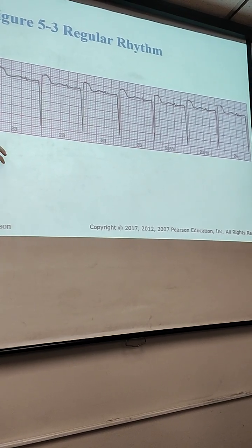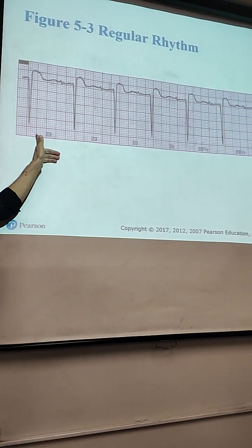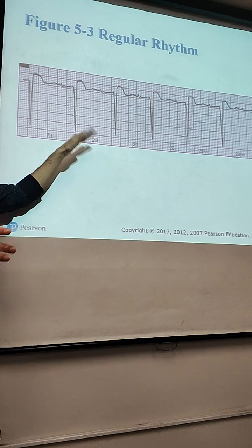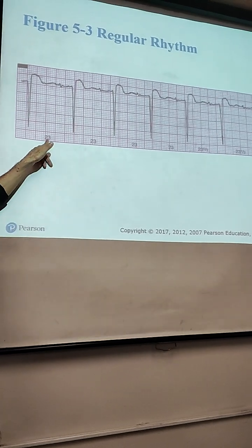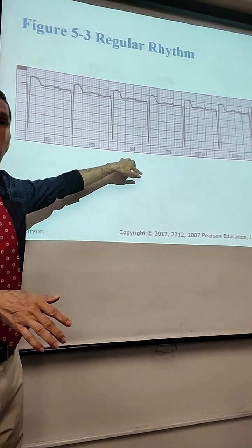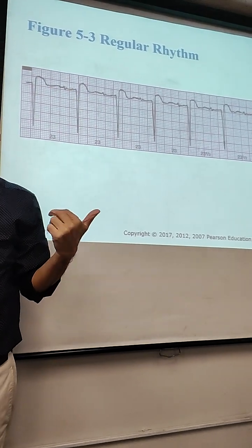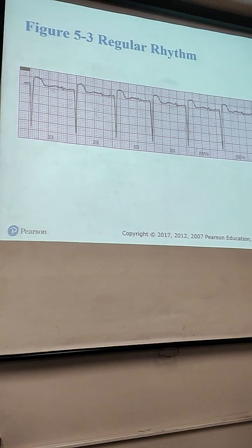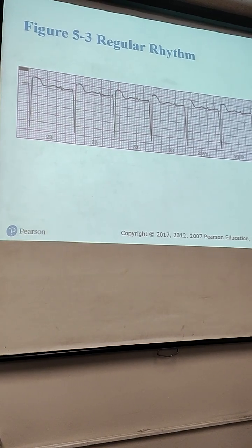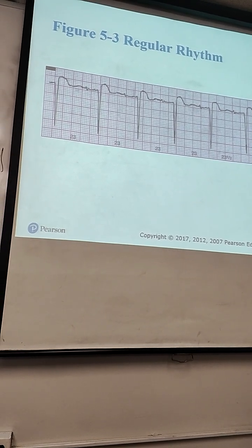If this is 23 and the other one was 21, whether less or more, that's fine. And the next 23, 23, 21, 21, it can be 2 more or less. You can go beyond 2 blocks and below 2 blocks and it's still considered regular.